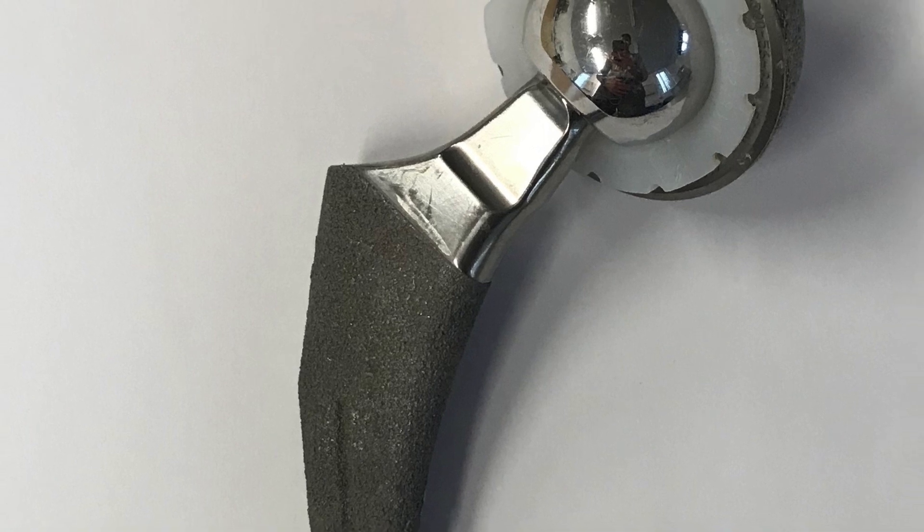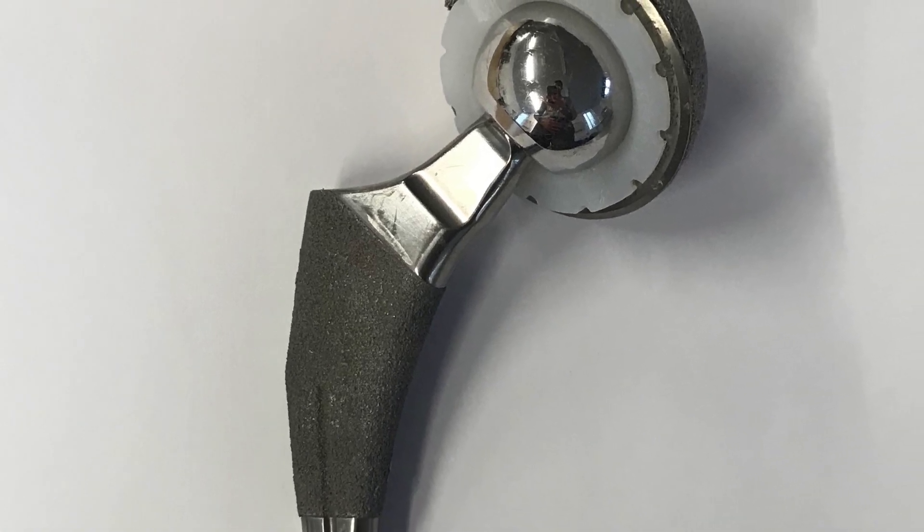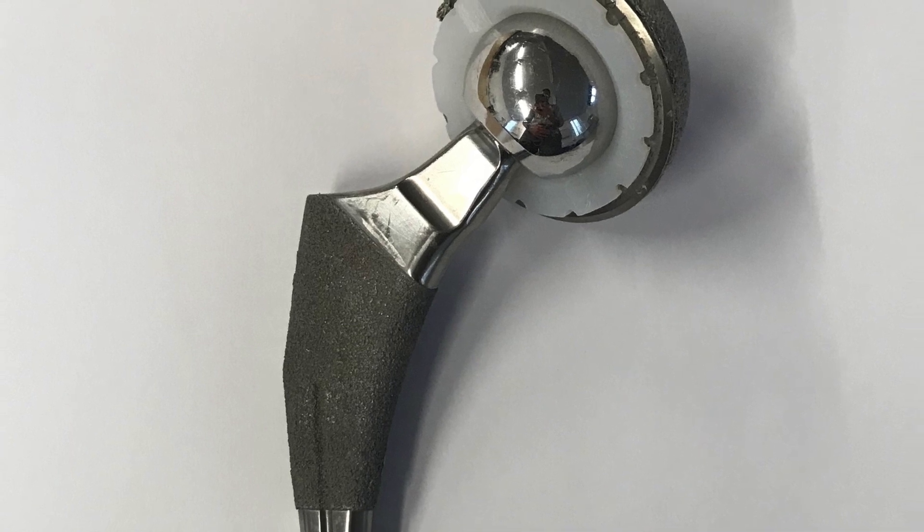The titanium shell then utilizes a liner, which is the moving part against which the head of the stem articulates, and it's this liner that will wear out over time. So it's the crucial part of the hip replacement where designers and manufacturers have focused their attention over the last 15 to 20 years. There are three materials that make a good liner — metal, ceramic, or plastic — and these are used in various combinations.